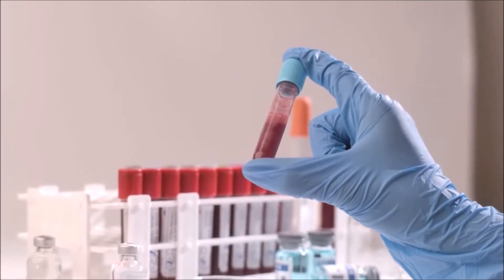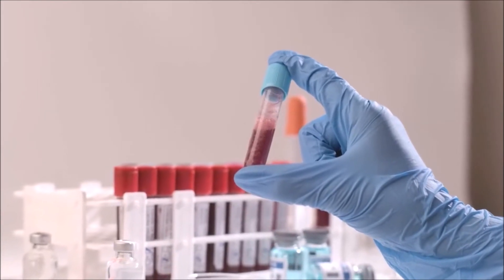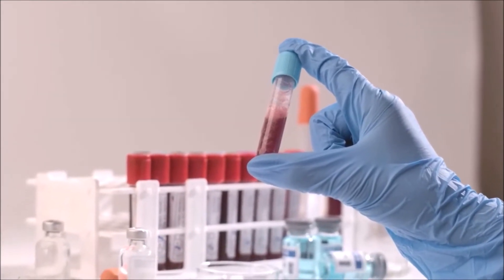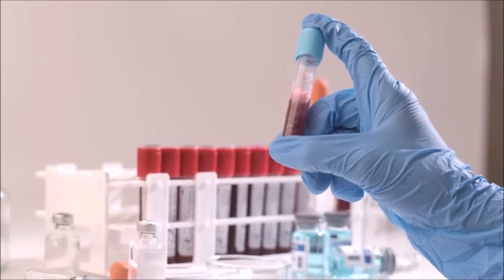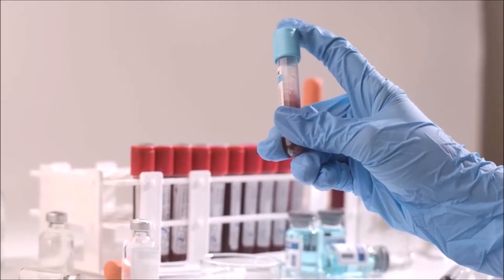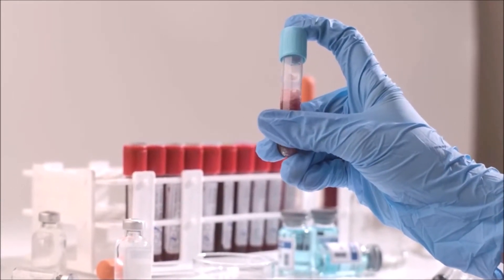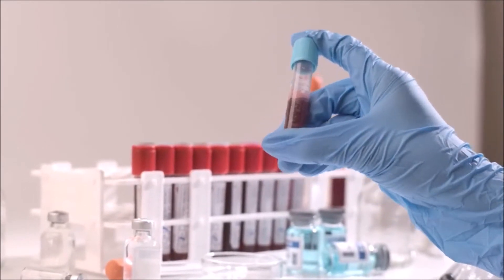There are five commonly used blood collection tubes. These are the red top tube, known as the serum tube; the EDTA purple or lavender top tube, which we use to perform the complete blood count; the blue top tube, which is the coagulation tube; and the green top tube, which is the heparin tube, sometimes known as the plasma tube. We sometimes refer to the gray top tube as the sodium fluoride tube.